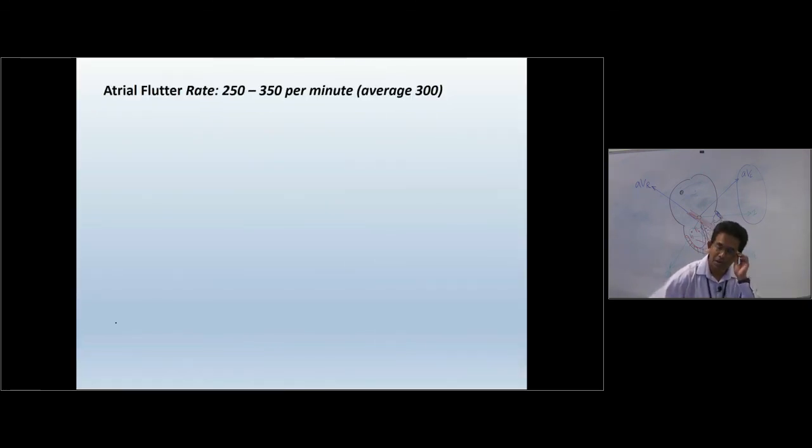All right, a couple of abnormal rhythms. I think Lisa discussed about 5, maybe 7 or 8 abnormal rhythms. I think she discussed some blocks as well, didn't she? Yeah, first degree, second degree, and various blocks as well.